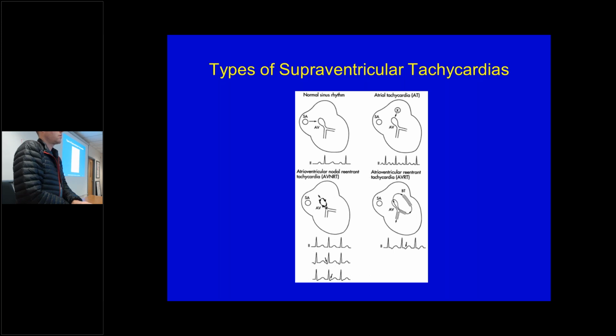Or the P wave? It's not inverted here. You might be looking at a T wave. Look at where the arrows are pointing.